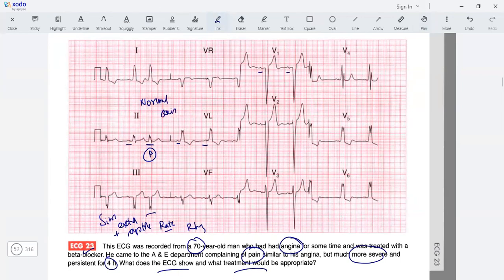The axis is normal. Looking at 2, 3, AVF - the QRS is wide and slurred. T is normal. 1 AVL shows wide QRS with an M pattern, same M pattern in V5 and V6. There is a deep S in V1 with some ST-T changes, inversion and depression. These are all suggestive of left bundle branch block. We have sinus rhythm with extra systoles and left bundle branch block pattern.